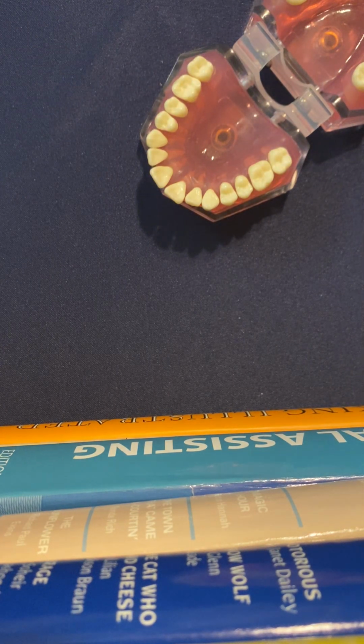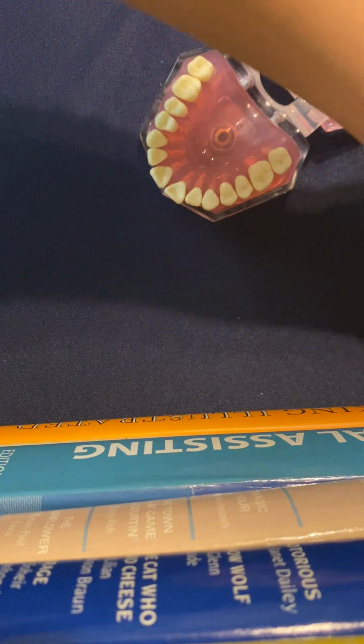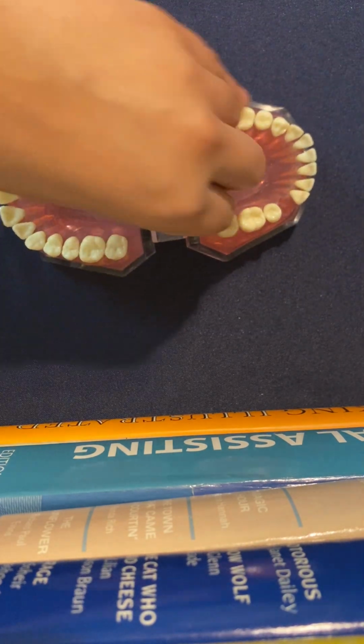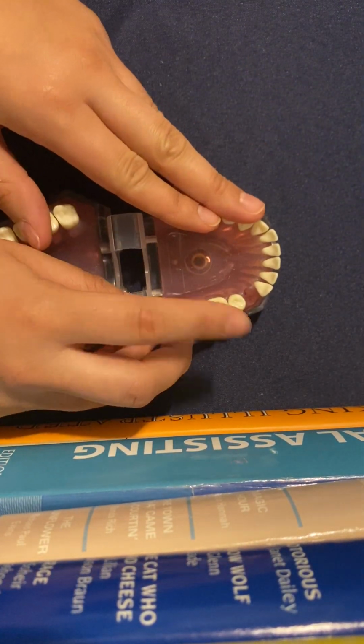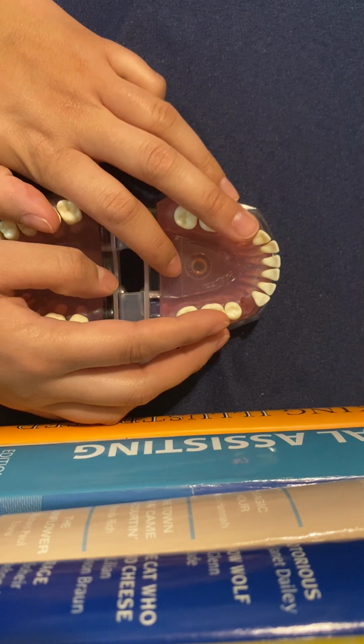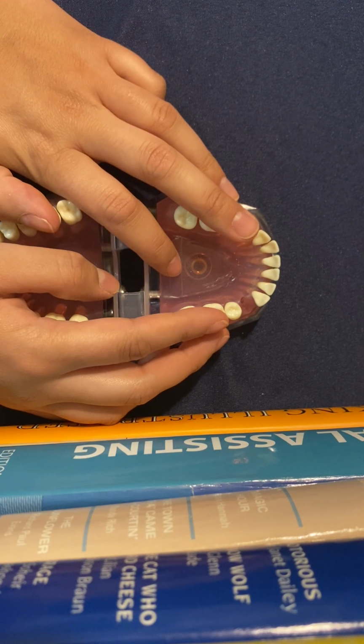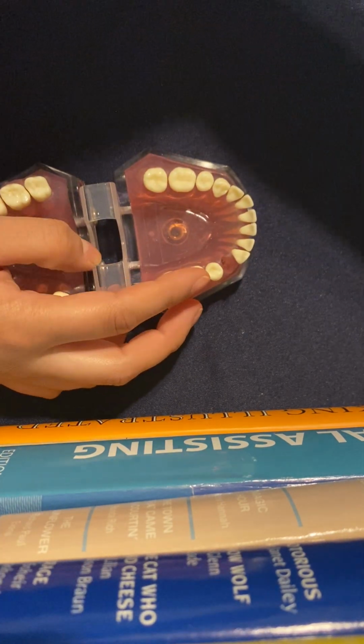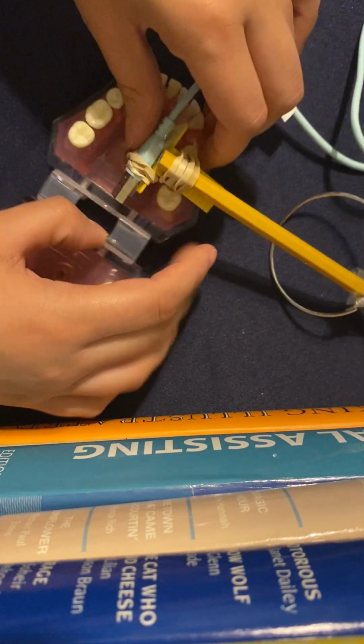Okay. Oops, I think I lost my spot. I think we did maxillary left premolar, so now we're doing number 12, which is the maxillary molar. So that would be this one. For this one, you're going to want to center it on the second molar. Oop, grabbed the wrong one. I grabbed the one that was closest to me.